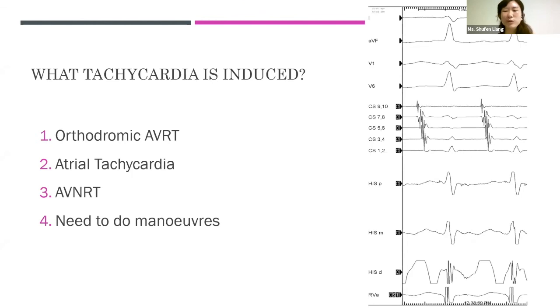You know, Mr. Wong, for your left-sided SVC case, I've never actually had an AVNRT with a left-sided SVC. But I actually have a left free wall pathway with a left-sided SVC with CS atresia here. That means there's no CS OS.